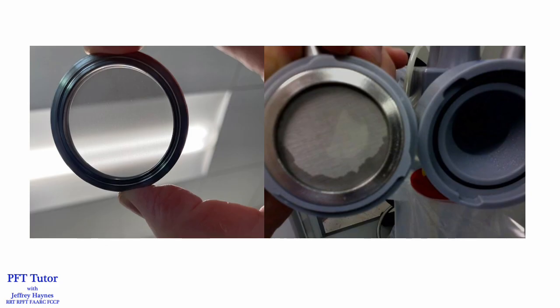The other problem is that condensation can build up on the screen as shown in the right panel. This was more of a problem with the older unheated models, but it can still happen with the heated pneumotach if the room temperature is kept too cold. So if someone likes the AC on and they get the room temperature down to 20 or less, this can absolutely happen even with the heater in place. Now, many of you probably don't use this pneumotach, but if you use a disposable pneumotach, you can just replace it with a new one if you suspect that a problem is present.